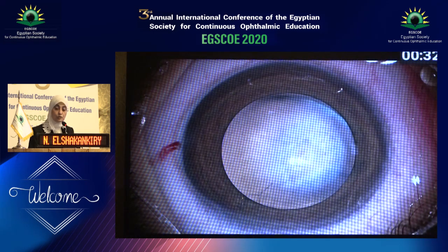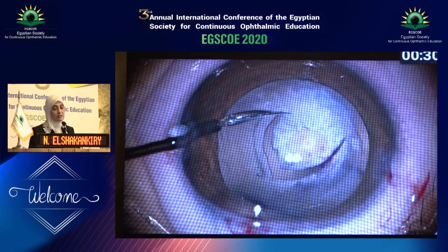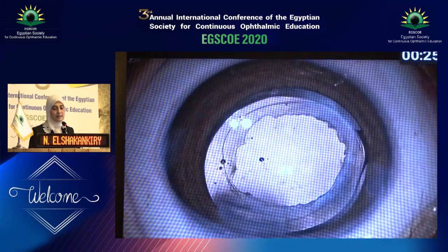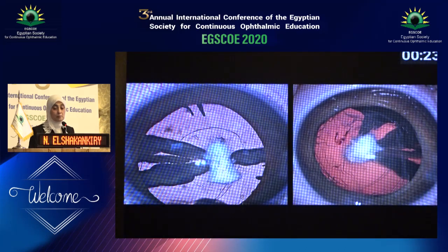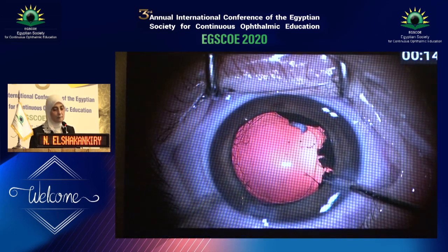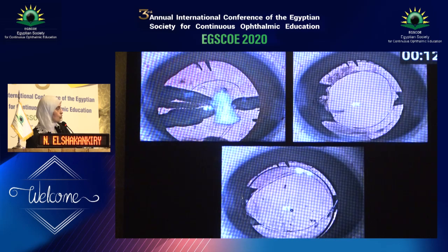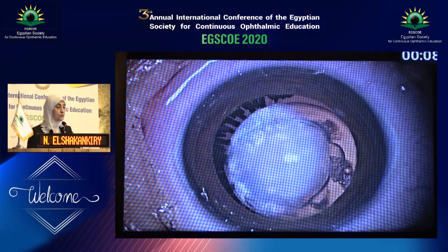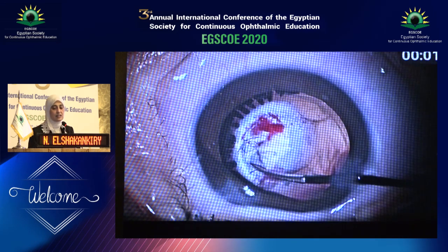And in cases of a total posterior capsule, we cut the posterior capsule and perform the vitrectomy and implant the IOL inside the capsular bag. And even when we have prominence like that of the ciliary processes, no problem, they don't bleed. In these cases, we clear the visual axis for secondary IOL implantation, or we implant directly in the sulcus and perform optic capture technique. And this is the final case with a baby with persistent hyaloid artery after irrigation aspiration and cutting.